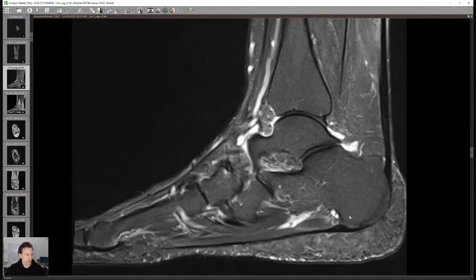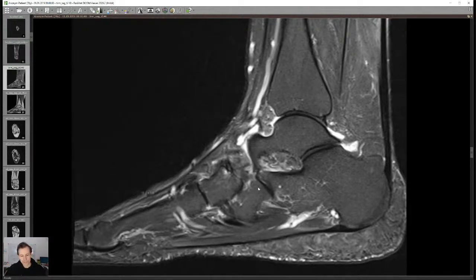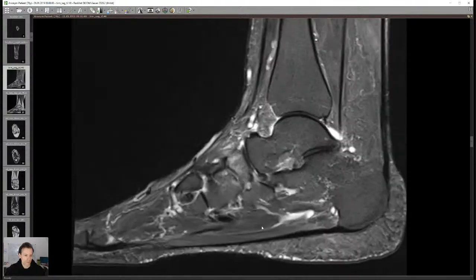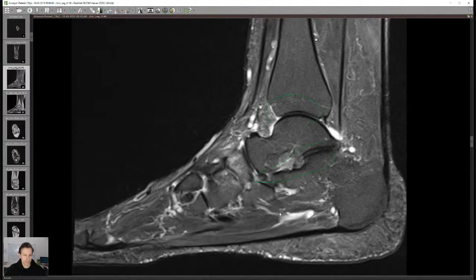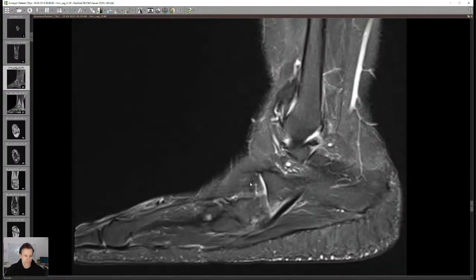Hassan is asking whether this is the standard way to review an ankle joint or just my way. It's certainly my standard way — always the same approach regardless of what the referring physician wants to know. Starting with bones, then ligaments, then syndesmosis, then all other ligaments, then tendons, and lastly soft tissue and musculature. A very organized approach so you don't miss any minor findings.